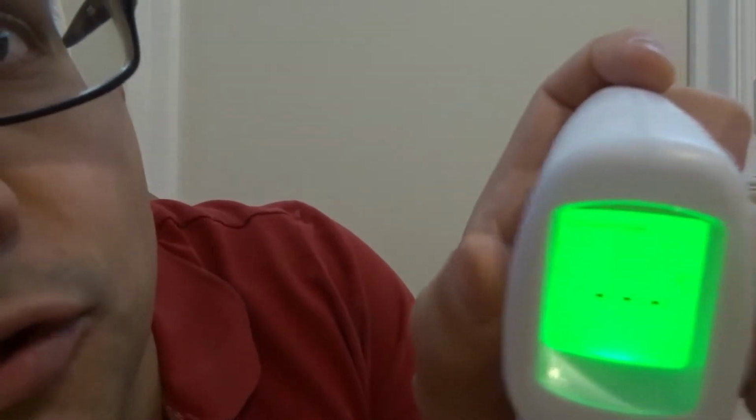Okay, we also have surface temperature, if I'm measuring the temperature of, let's say, this wall over here. Or we have body, which is, if you want to measure someone's temperature, okay? So, I'm just going to demonstrate the body one, but you can use it to measure the temperature of a wall, let's say, or surface. You can use it to measure the ambient temperature of the room, but body is the one that I'm going to use, but you can select your own mode.